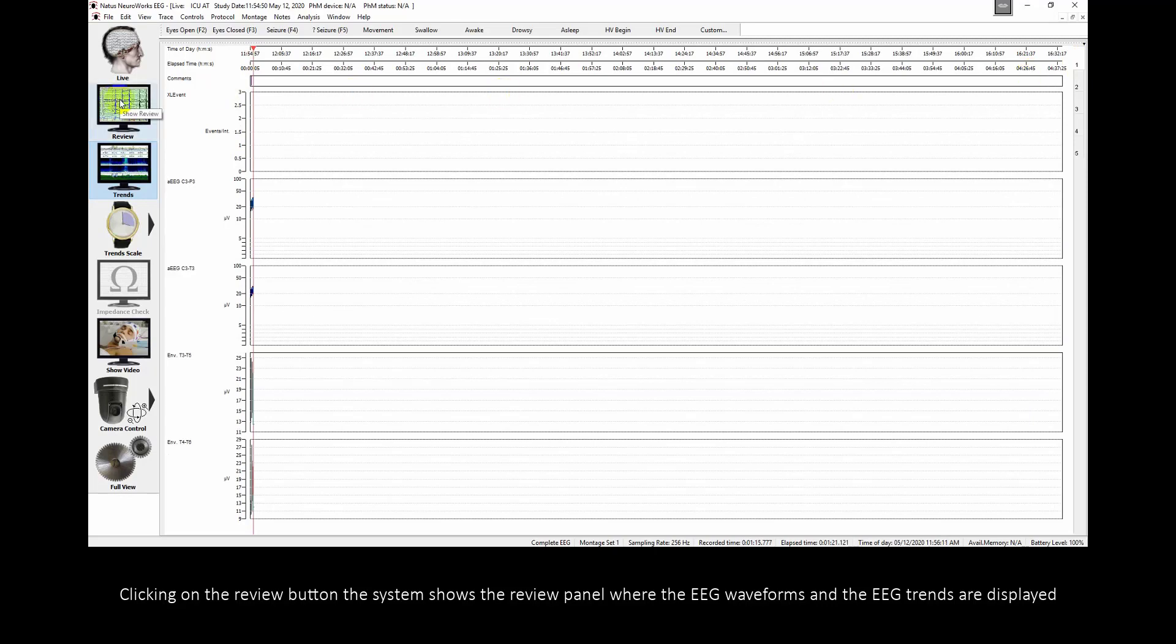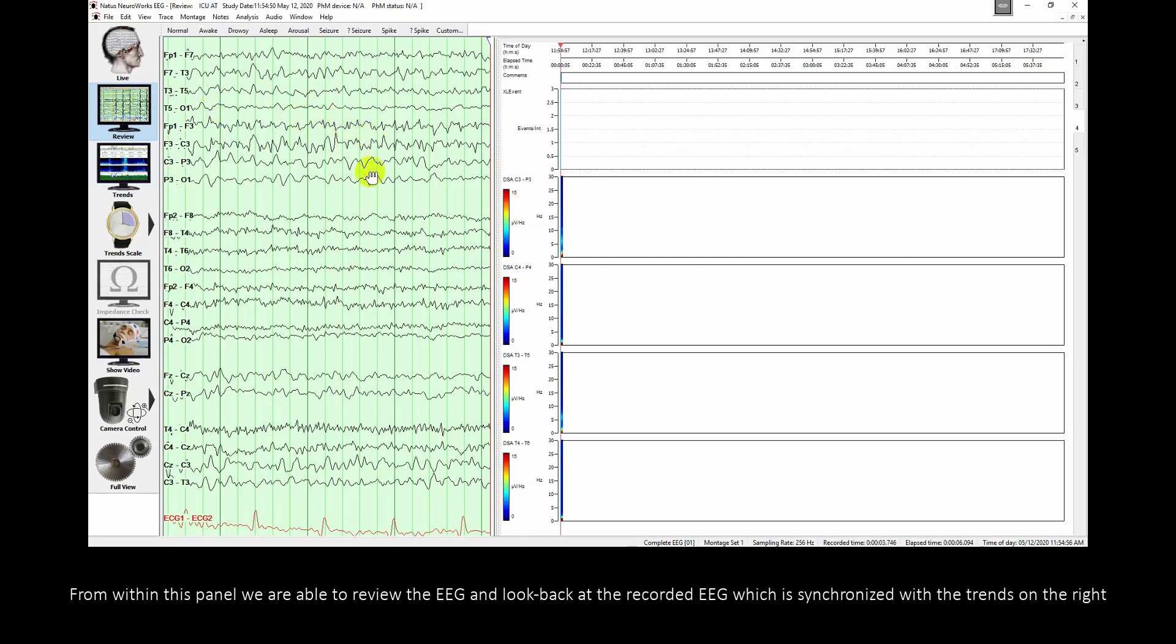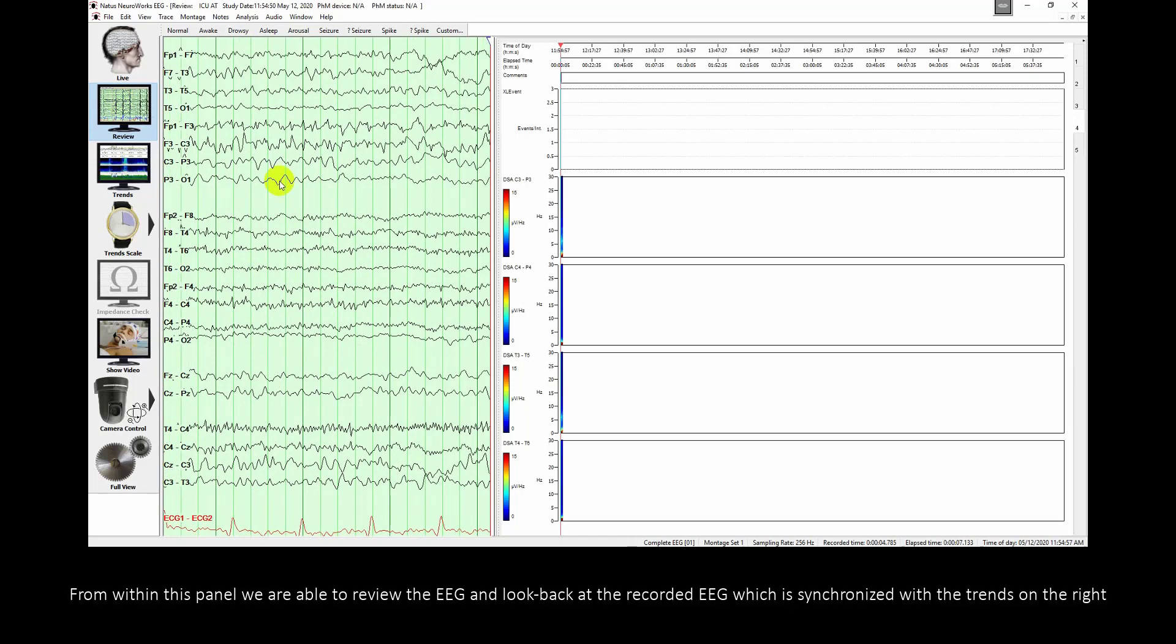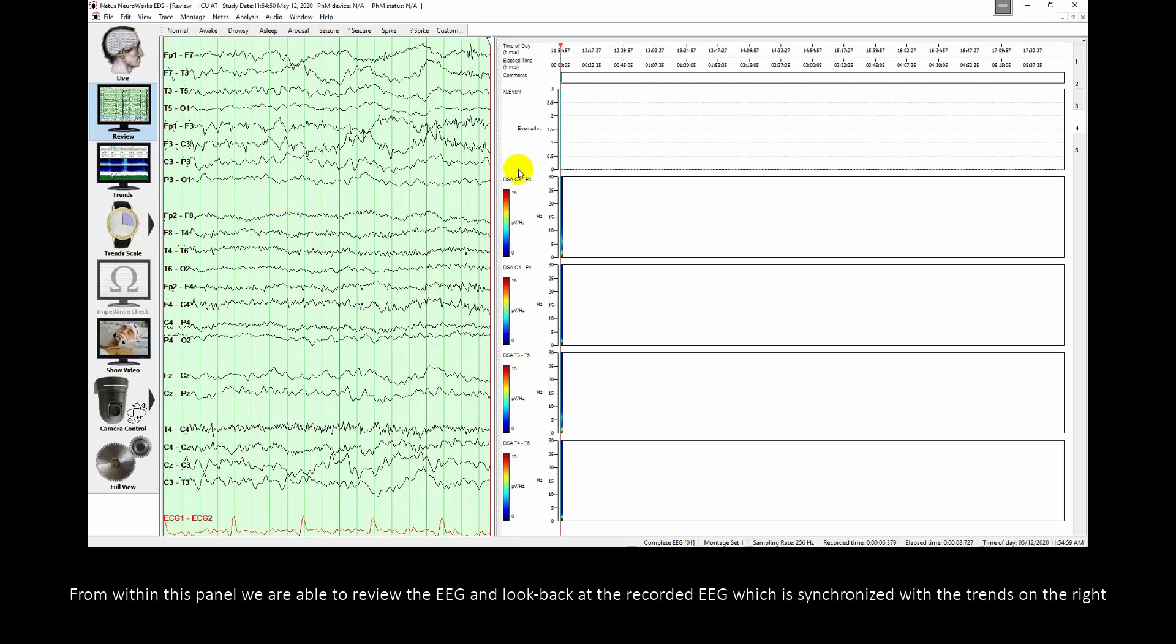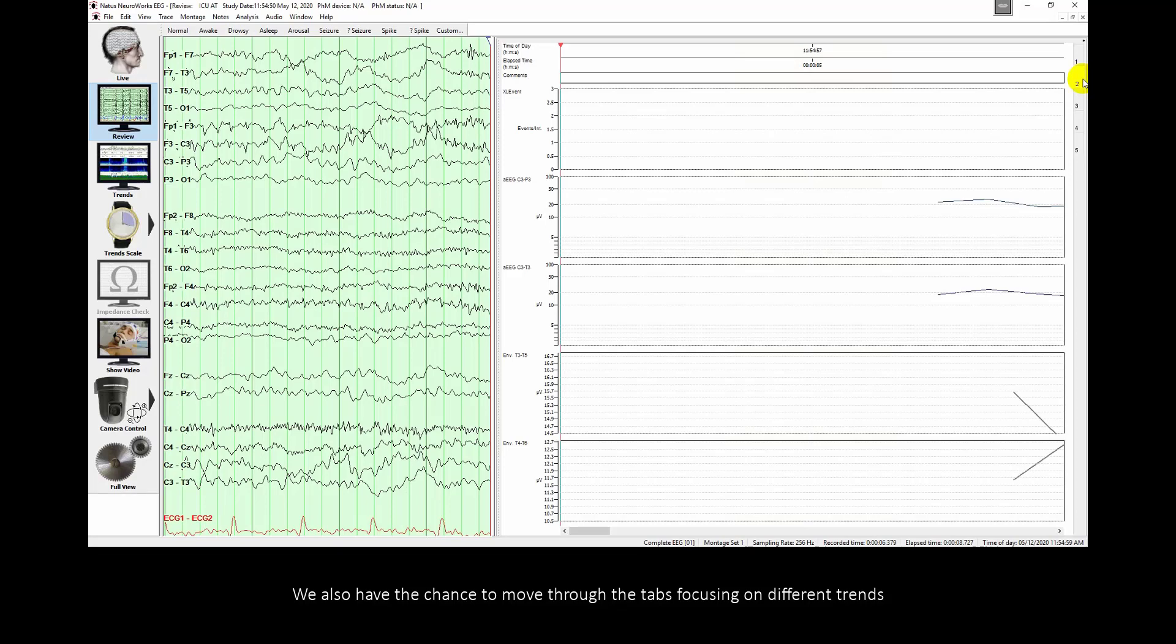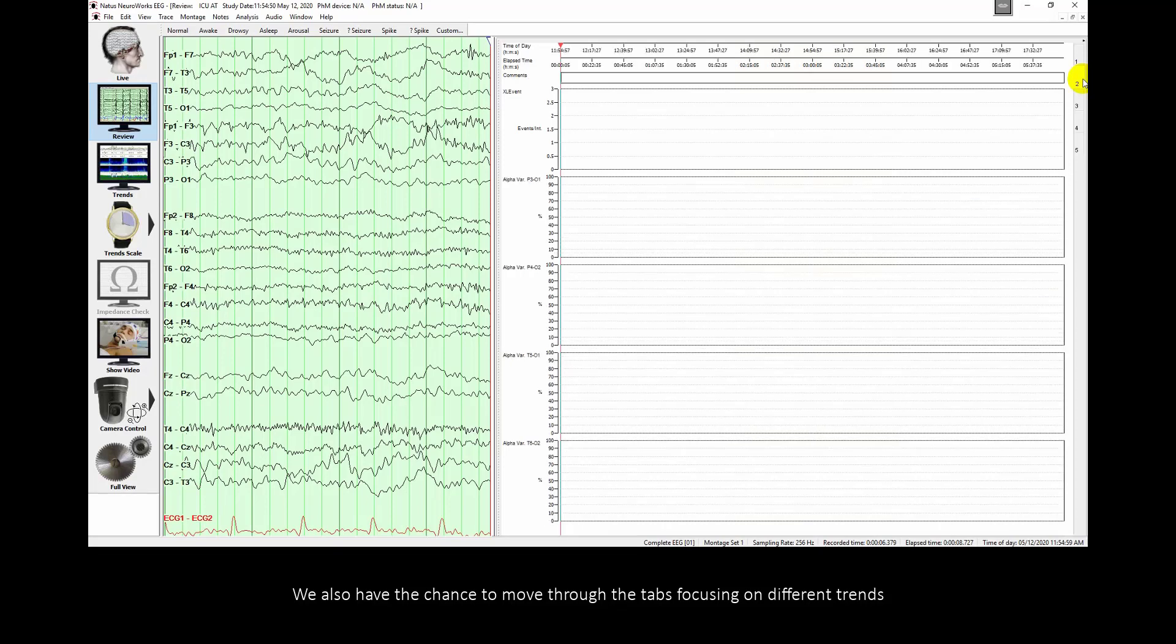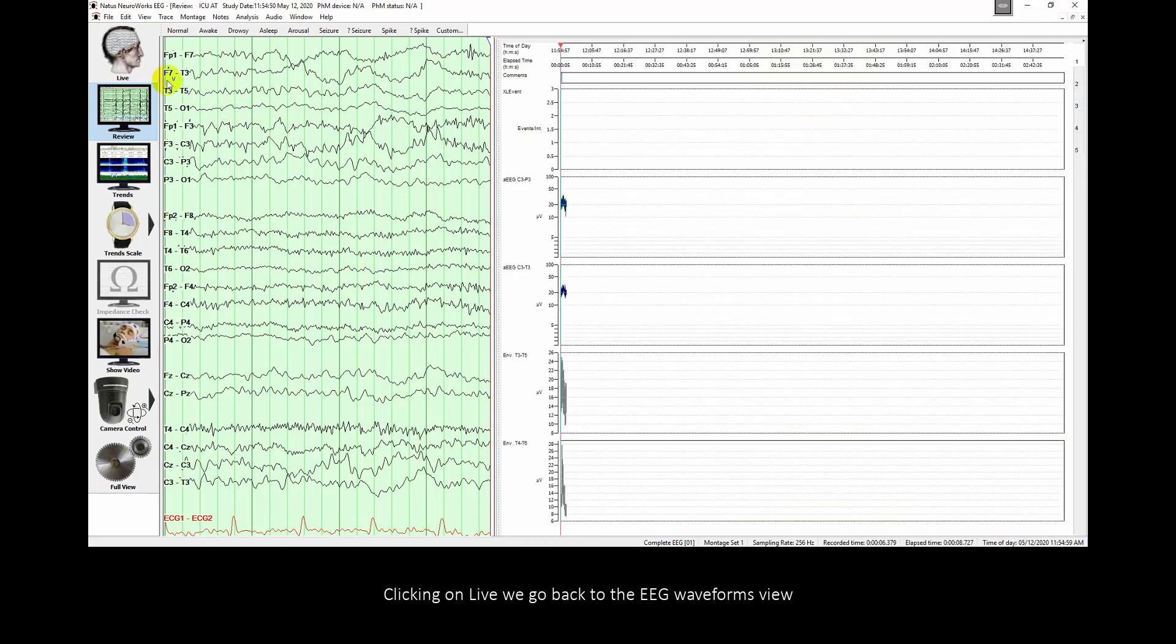Clicking on the Review button, the system shows the Review Panel, where the EEG waveforms and the EEG trends are displayed. From within this panel, we are able to review the EEG and look back at the recorded EEG, which is synchronized with the trends on the right. We also have the chance to move through the tabs focusing on different trends. Clicking on Live, we go back to the EEG waveforms view.